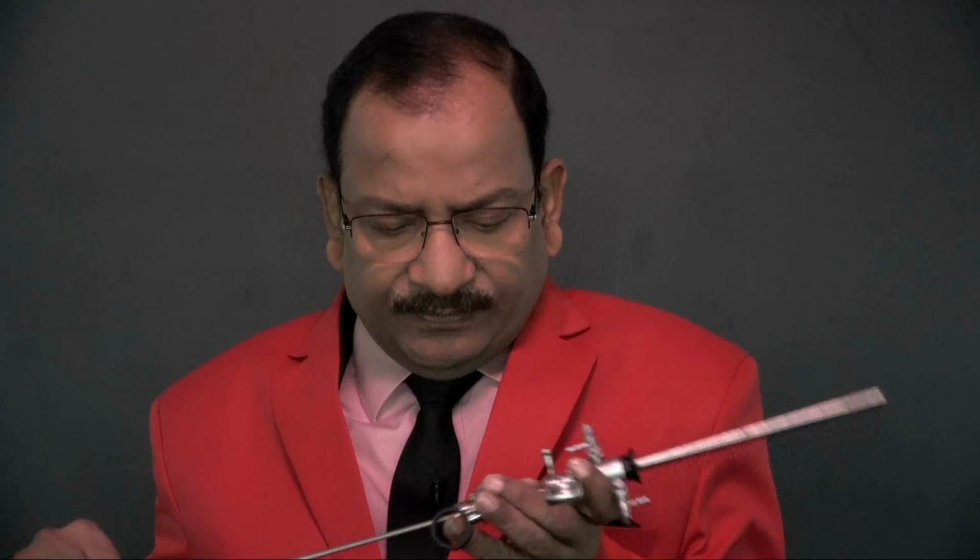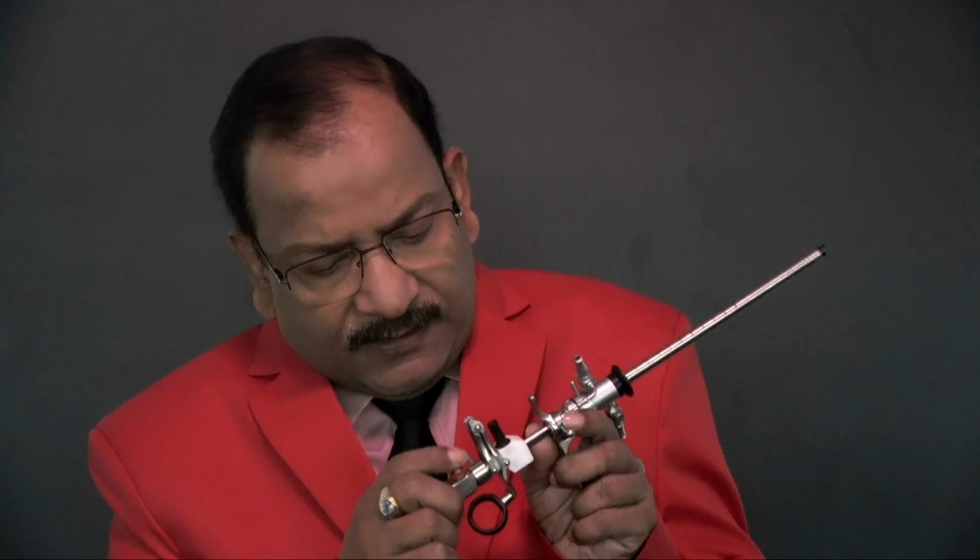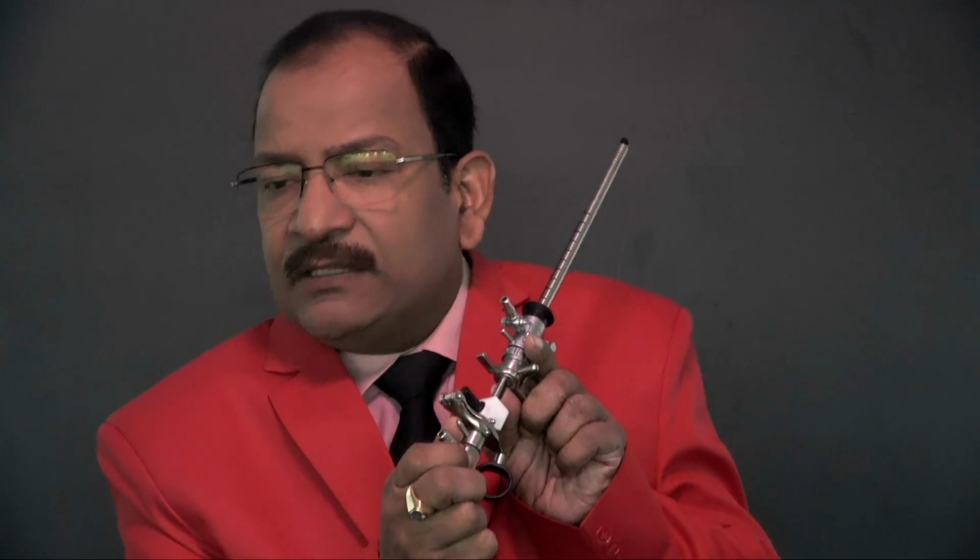After that, this is the outer sheath. The outer sheath has two functions. One is suction, meaning fluid exit, and the other is that it acts as a cannula. So this is the outer sheath attached, and again I will rotate clockwise. This is also locked. And lastly you will introduce the telescope. Here is the telescope. Again there are two lines, and rotate clockwise, it is locked. Now all assembled together is called the resectoscope.